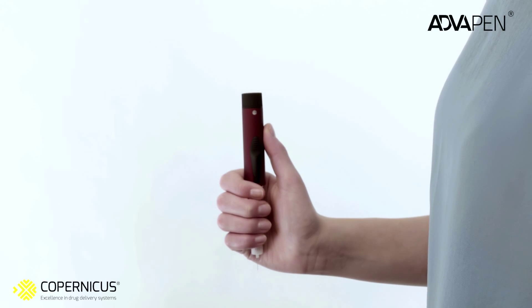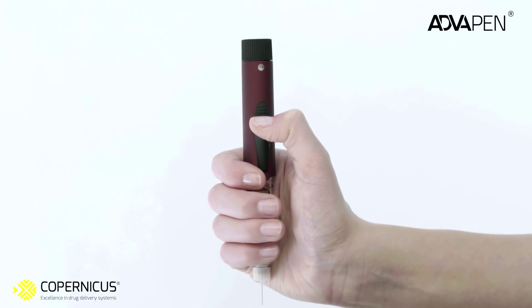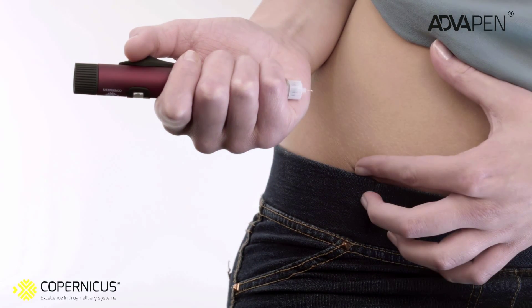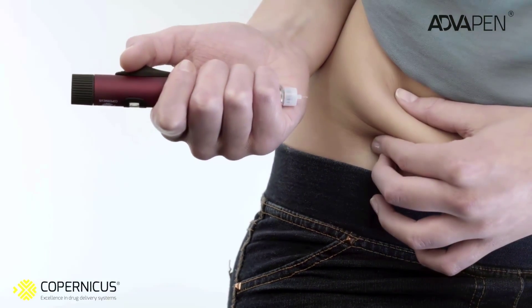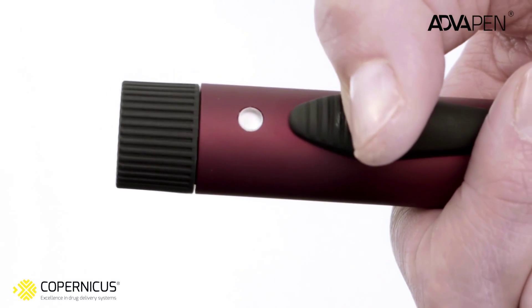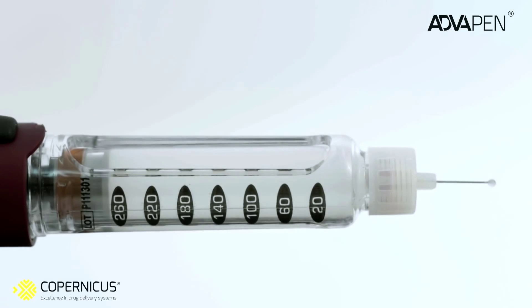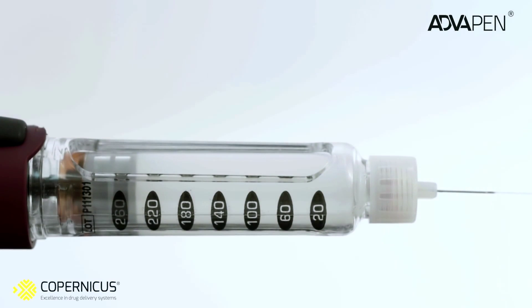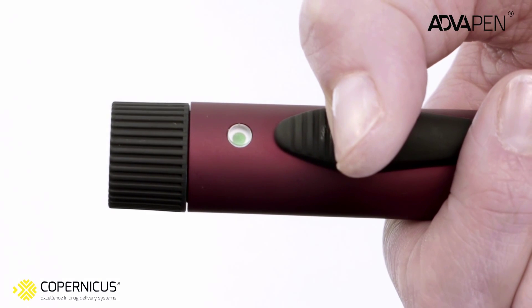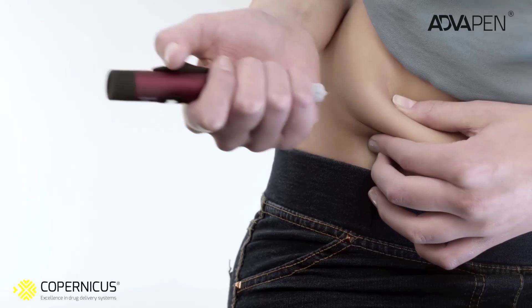Grasp the pen injector firmly with your thumb snugly on the release button and the rest of your fingers holding the cartridge holder. Lean your wrist against your body to stabilize your hand, then insert the end of the needle into the subcutaneous tissue. Using your thumb, slide the release button in the direction of the needle. The injection is almost painless as the insulin is administered smoothly at constant speed. Hold the trigger until the green dot appears in the window, signaling the end of injection. Count to 10, then remove the needle.